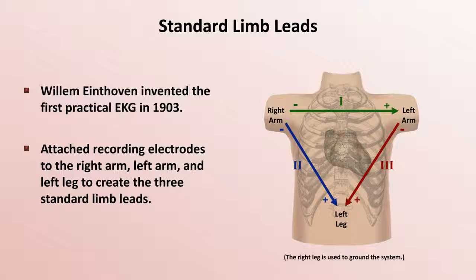These three leads make a nice little equilateral triangle, but I can imagine that some of you are scratching your heads because the left leg is obviously not located at the umbilicus as shown, and therefore these leads as shown are a substantially inaccurate ideal realization of what the geometry actually is. This is something that bothered me quite a bit when first learning EKGs, seeing lots of diagrams very similar to this one. All I can suggest is not to worry about it and just accept that this triangle is actually a much better description than it seems it should be.